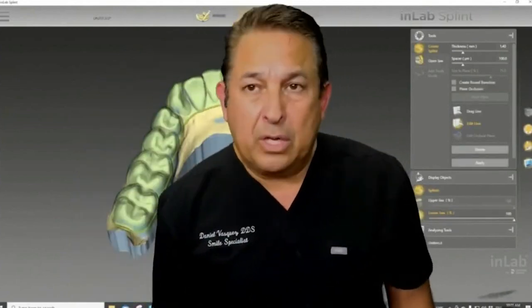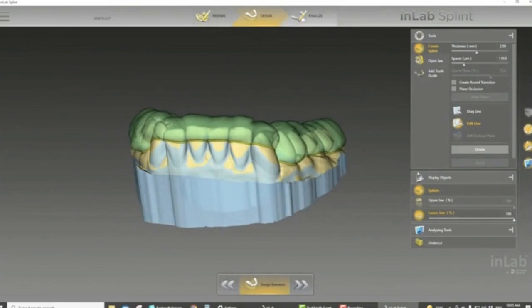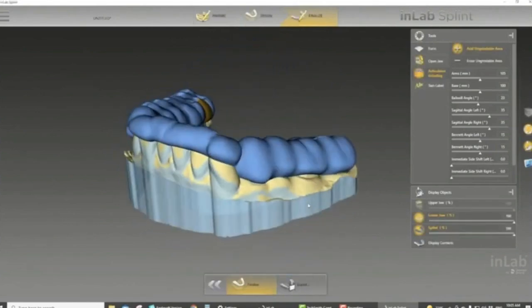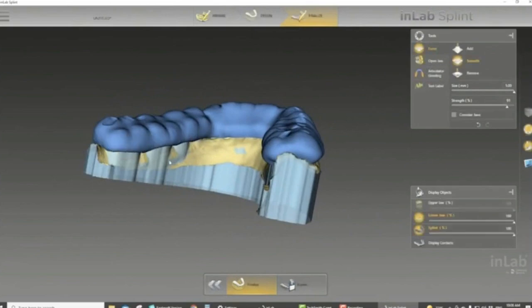So if you have a scanner and you have software, like any lab software can do a splint, correct? This is one of the services that we offer in our office, and we do probably an average of 7 to 10 a week. The dental hygienist already scanned the patient, so if the patient needs this, all we have to do is modify the bite. Whenever we design it in the software, we can design it without a problem with that open bite that we recorded.